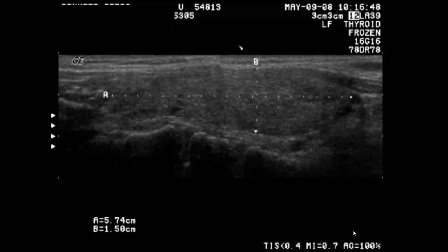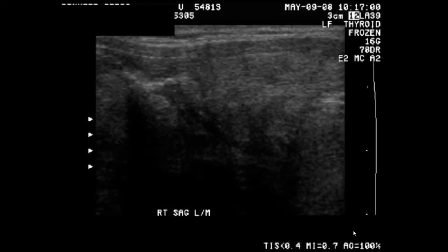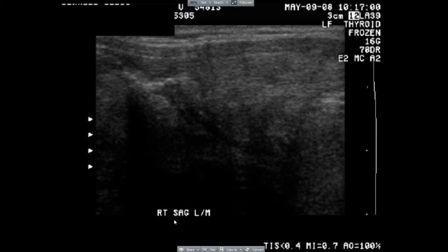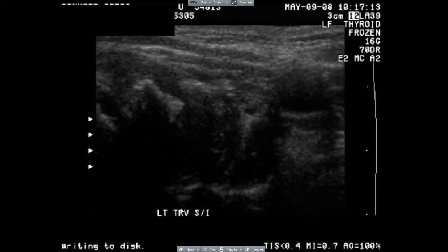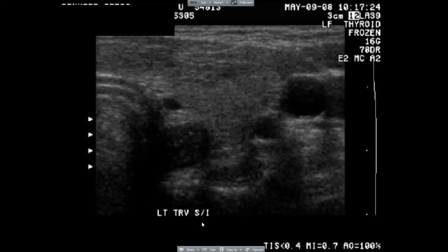Here in these images, the ultrasonographer has moved her probe to give us a sagittal image, and she's labeled it accordingly—it says right sagittal. It's important to understand the orientation of the probe so that you can eventually understand the photos.